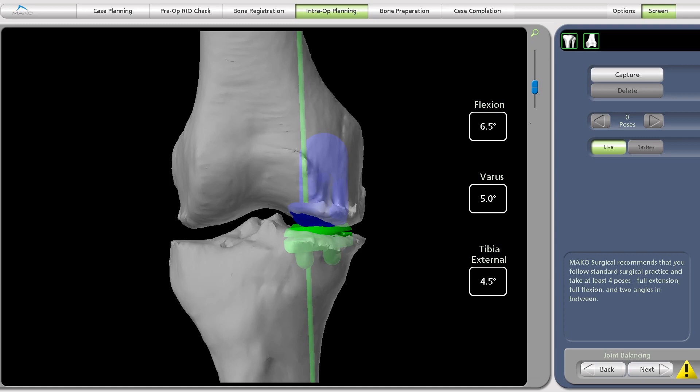Prior to any surgery, we get a CT scan of the patient's knee, and from that make a three-dimensional reconstruction so we can analyze in all three planes the area of deformity, as well as areas that are healthy. This patient has been confirmed to be an excellent candidate for a partial knee replacement. We will then confirm that the damage is isolated, and also that the lateral compartment is just as healthy as we saw in the x-ray, and that the notch and the cruciates are also healthy.